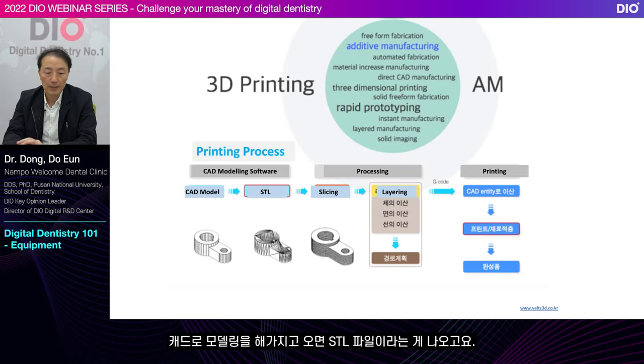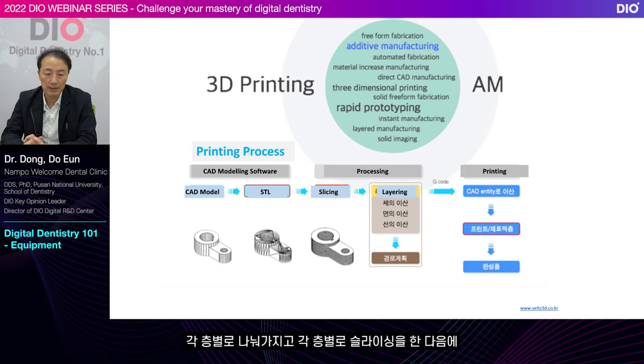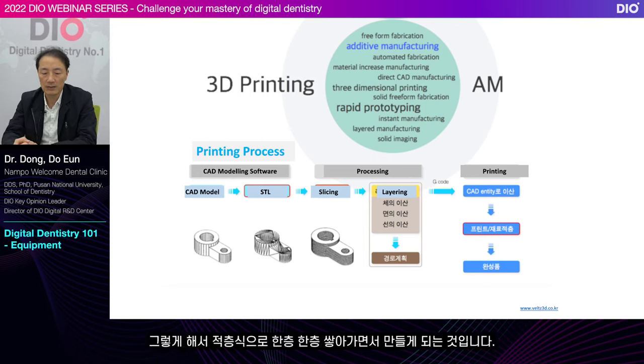First, you do the modeling using CAD. Then you get an STL file, which you slice into thin layers using CAM software. Now the file would be a compilation of many thin slices. And then you send the file to a 3D printer. The printer prints each layer one by one. And these layers stack up one by one to create the end product.